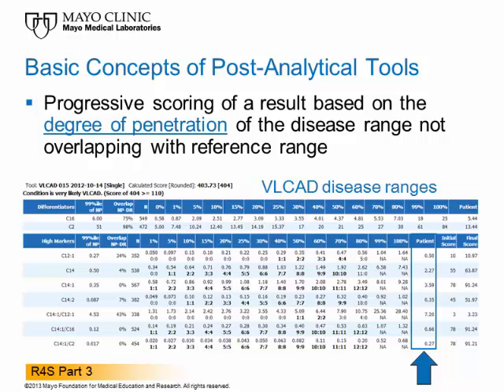The analyte shown in the top row of this table is the acylcarnitine species C12:1, and the measured value is 0.50 nanomoles per ml. On the left side, the table shows that the 99th percentile of a reference population is equal to 0.27 nanomole per ml.